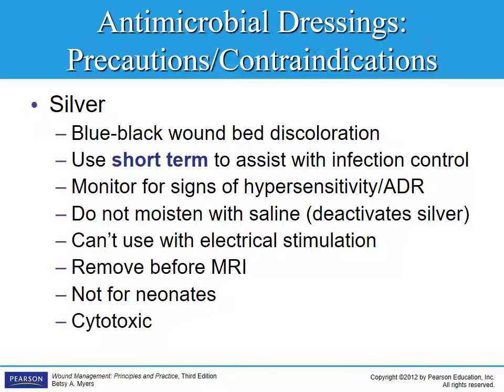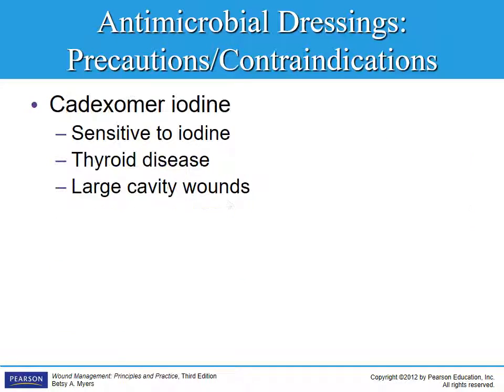You cannot use it with electrical stimulation. You have to take it off before they go to an MRI. You should never use it on a neonate, and with long-term use, it can be cytotoxic for immature epithelial cells and for keratinocyte migration.